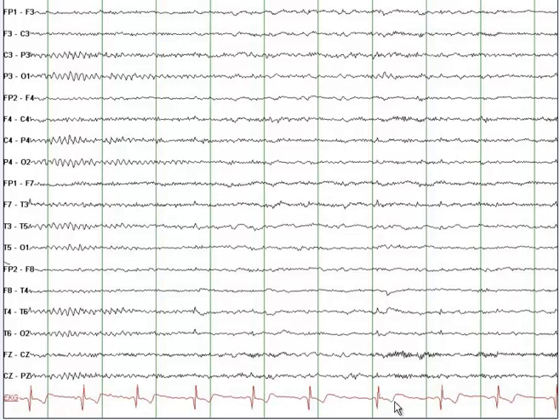ECG stands for electrocardiogram, which is a recording from the heart, not the brain. This particular EEG demonstrates stage 1 sleep.